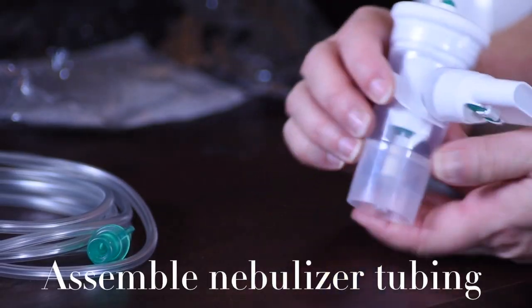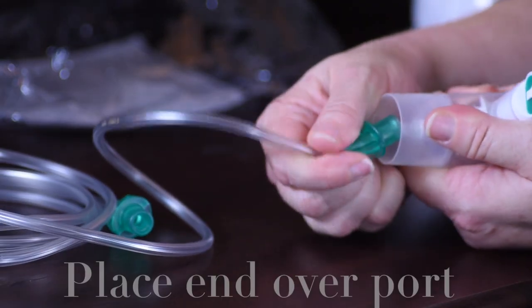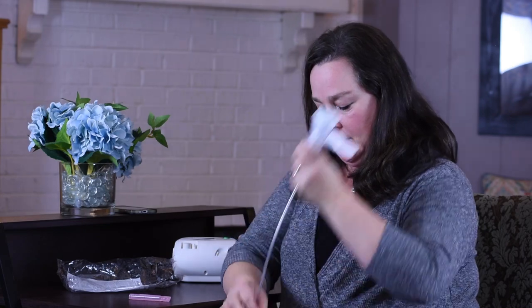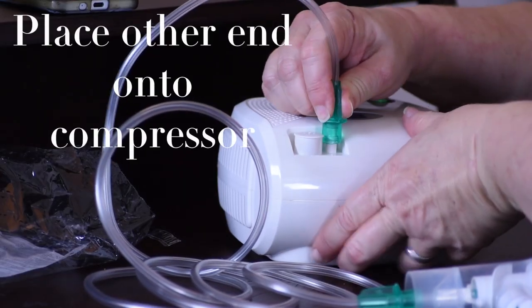Now you would assemble your nebulizer tubing by placing one end over the port on the bottom of the nebulizer cup, and the other end of the tubing will go onto the compressor.